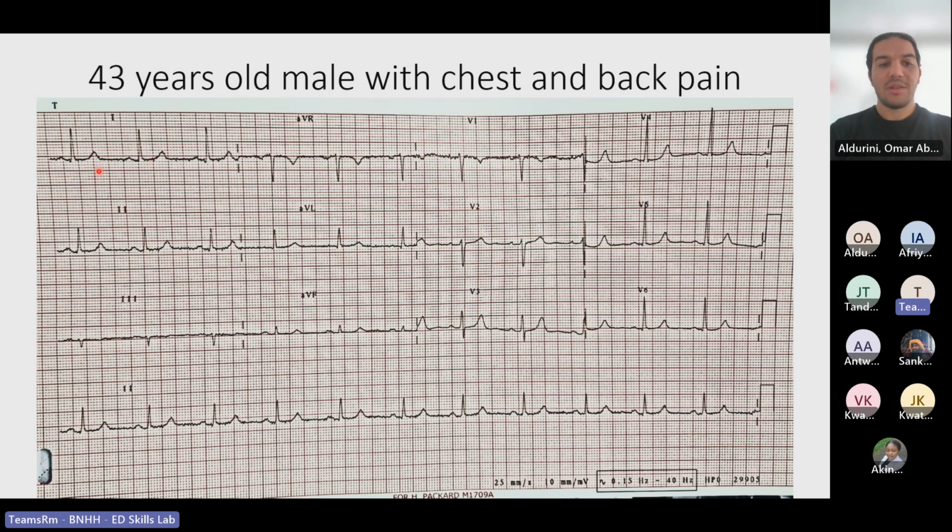When we did the ECG, first things first, is it a standard ECG or not? Yes: 25 millimeters per second printing speed, 10 millimeters per millivolt amplitude, and the P wave is upright in lead 2 and downright in aVR. So we have our standard ECG, and then we can apply our standard measures on it.